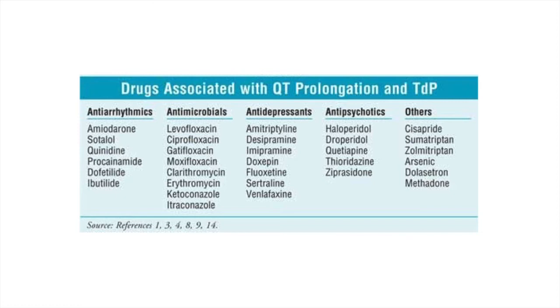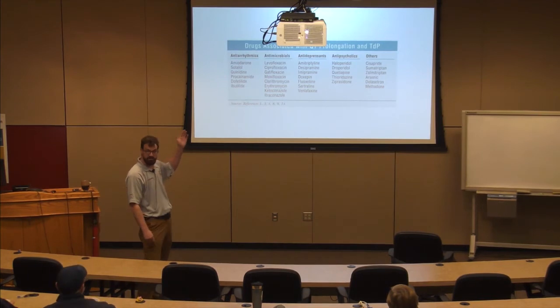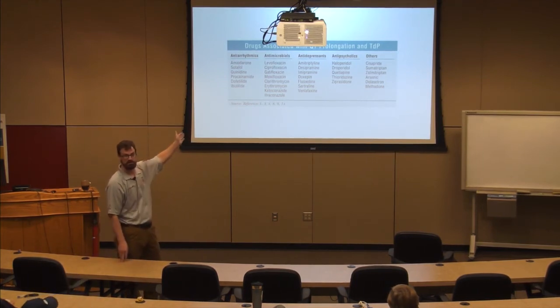But the joke is someone comes in and you find them and they're like, oh, I just overdosed because life's so difficult, right? And you look and it's an antibiotic. And the joke is, well, you won't get a UTI for the next month. Ha ha, let's go, right? It's purely psych. The truth of the matter is, this could be a cardiotoxic overdose. That person could be at risk for torsades. And how am I going to gauge what their risk is? I'm going to look at the QT interval. Okay?